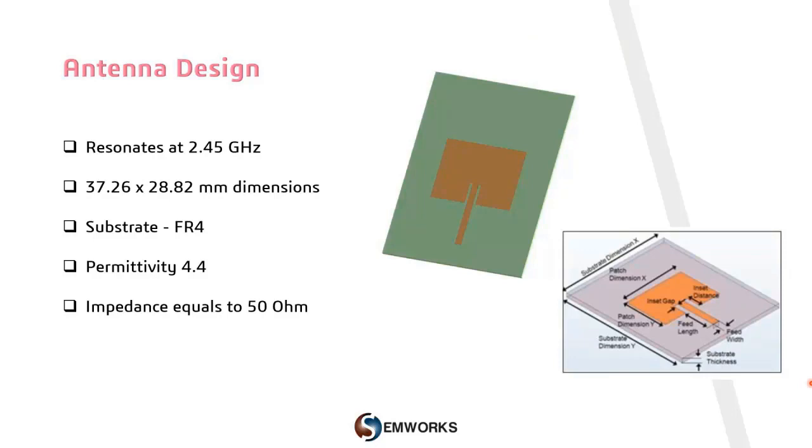My antenna consists of a basic rectangular inset-fed microstrip patch antenna that resonates at 2.45 GHz. The material used is FR4 for antenna design. Planar type designs are preferred for microwave imaging, as the antenna can be placed directly on the target.